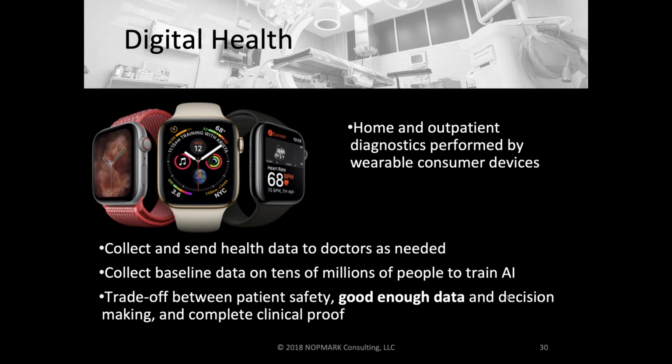But how they got approval is using some of the guidances the FDA is looking at piloting and implementing in the future, which is this idea, that bolded phrase at the bottom, called good enough data, which is that aspect of how much is good enough to prove, and this is from a testing perspective, right? The good enough data is your test data. What's the good enough data to show that the device is safe and effective to make decisions?